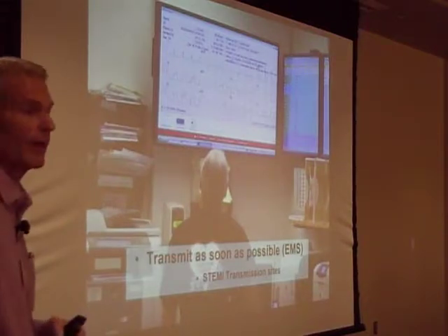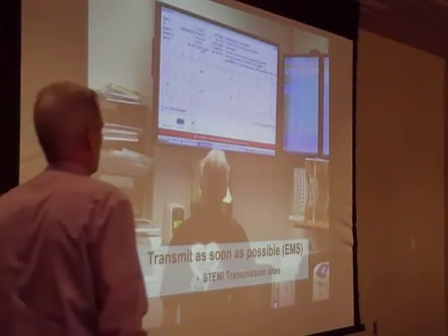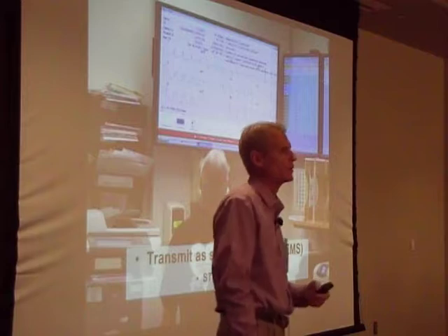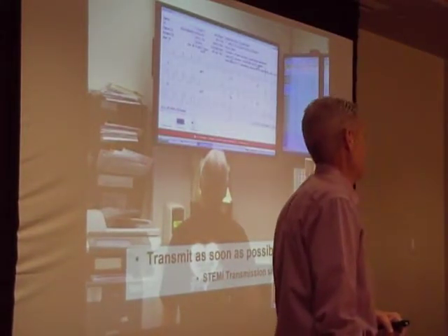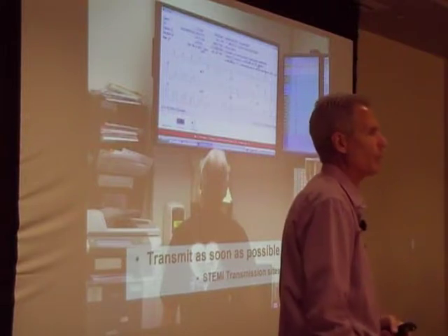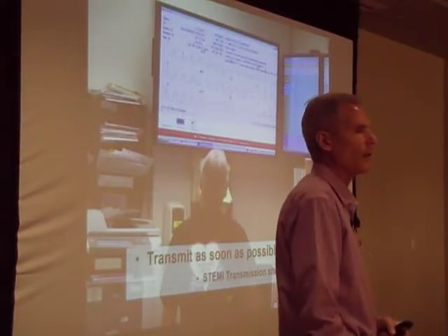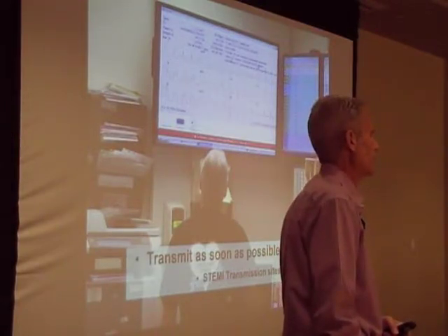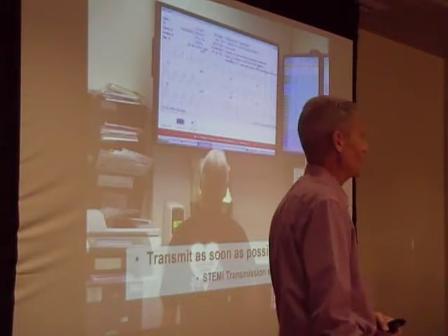And then briefly, I want to talk about transmission. When we first started transmitting years ago, a common complaint was, well, why am I wasting the time? I've got a short transport time. They're going to know what I have when I wheel through the door. How do you argue against that? Even if you're across the street from the hospital, is there value in transmitting the EKG? Yes, there is.